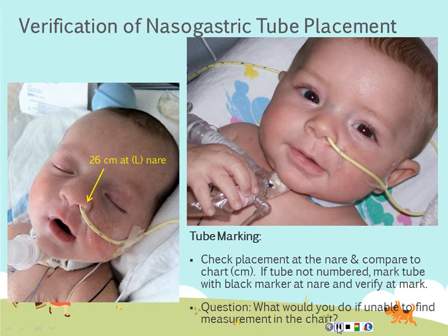At that point, if we have confirmed beyond all shadow of a doubt that it is in place, we are then going to document that it is in place and document the reading at that point of where it's located at the naris.